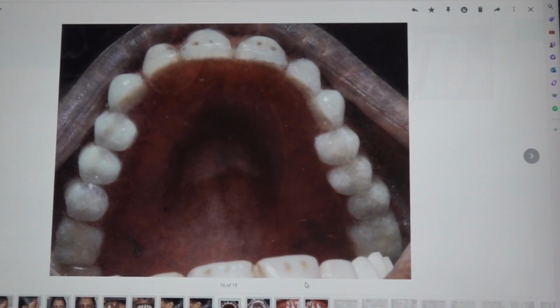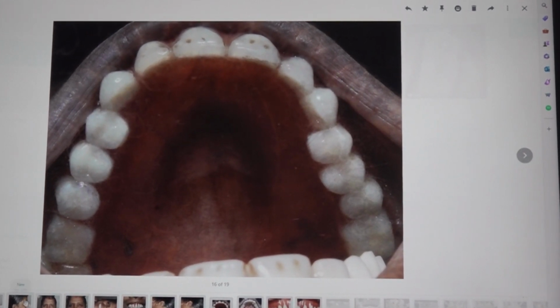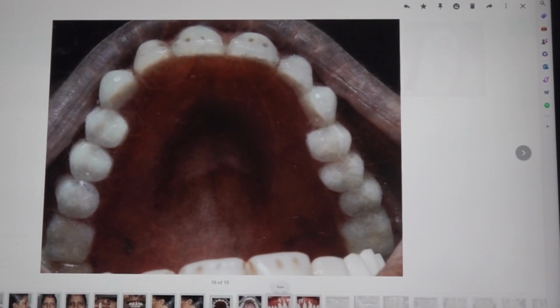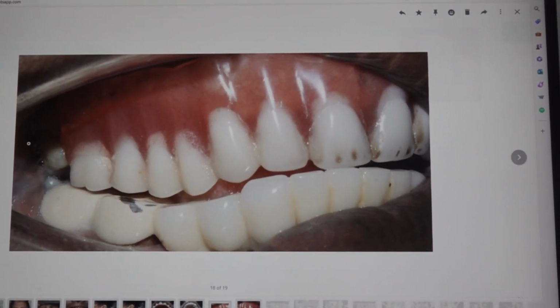Between the upper lip and the nasal. That is not because of the denture flange, sir. That may be one reason, or it may be the natural anatomy. Some patients have this fold here, right? We don't know unless we do it. So the flange is fully covering the palate? No, sir, horseshoe shape. Okay. So it's a classic combination syndrome.